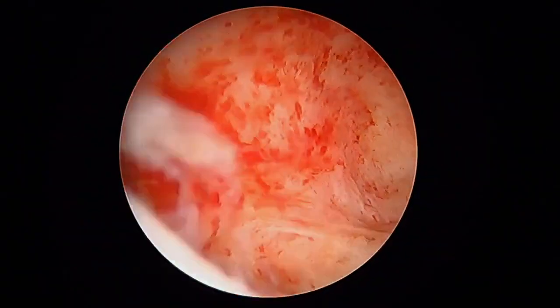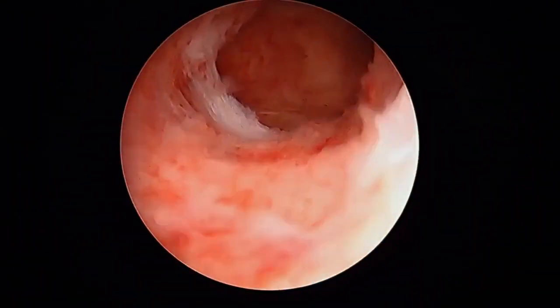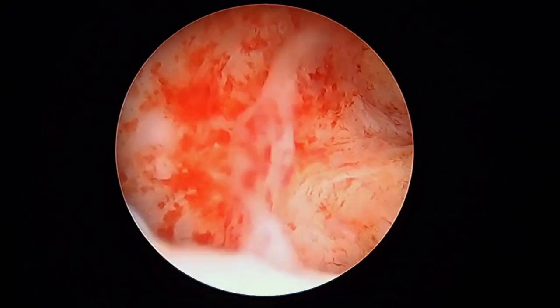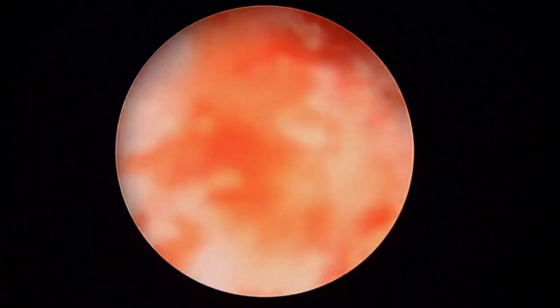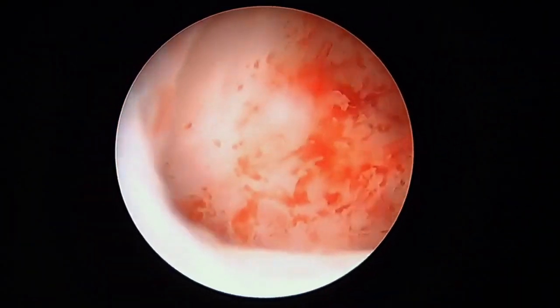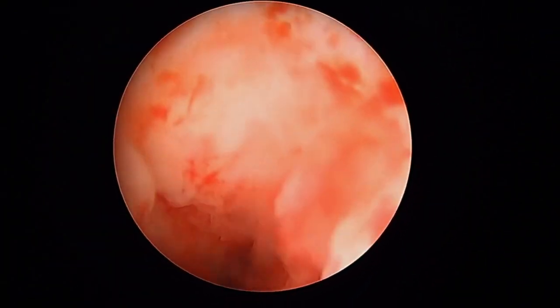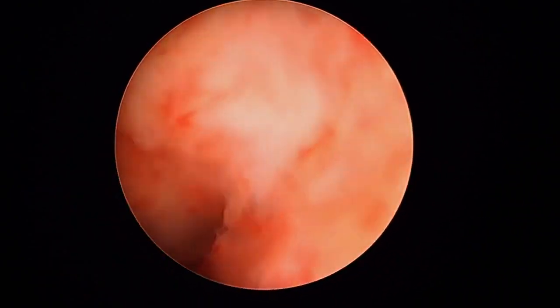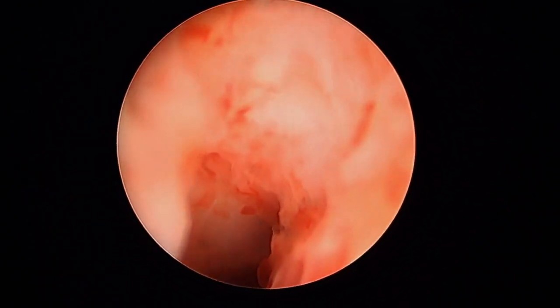This video highlights a hysteroscopic approach to intrauterine adhesions in a 32-year-old Gravida-1 Para-0010 patient with secondary amenorrhea after first trimester loss and blind D&C.